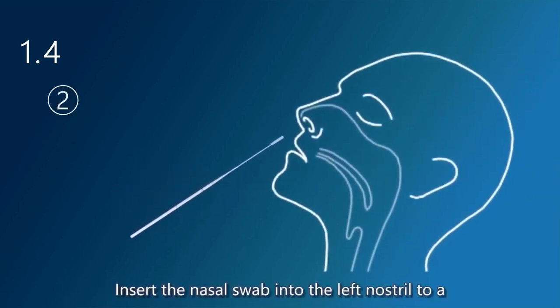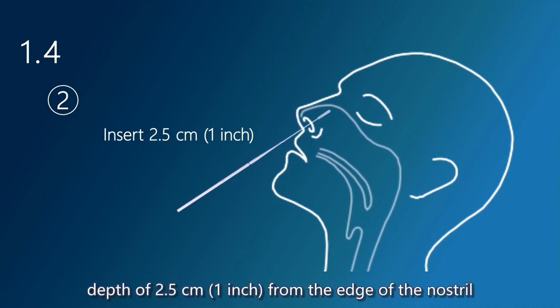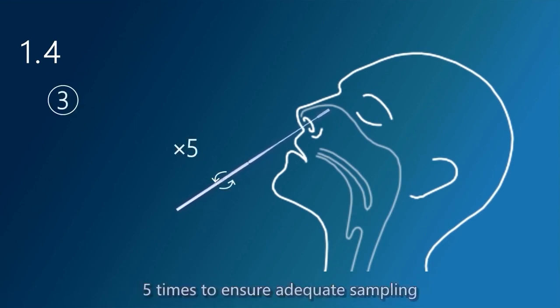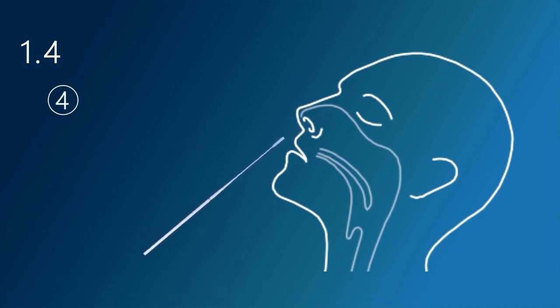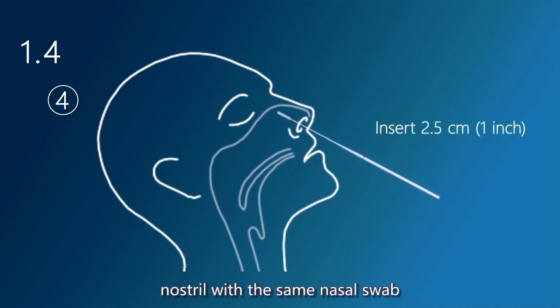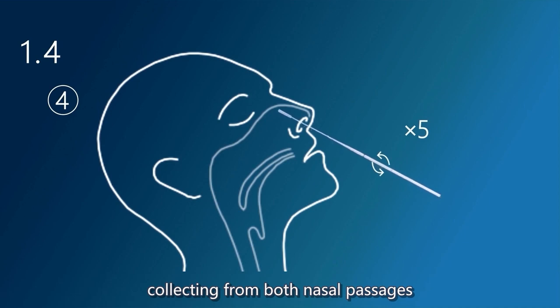Insert the nasal swab into the left nostril to a depth of 2.5 centimeters (one inch) from the edge of the nostril. Rotate the nasal swab on the nostril wall mucous membrane five times to ensure adequate sampling. Repeat the process in the right nostril with the same nasal swab, collecting from both nasal passages to ensure an adequate sample.